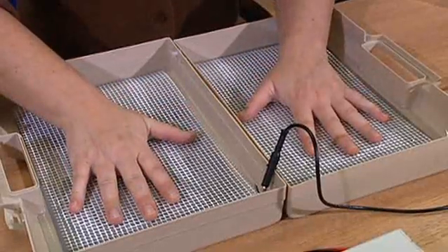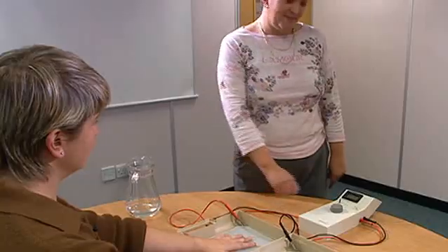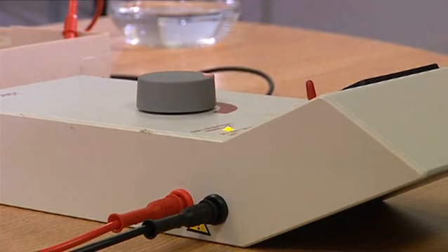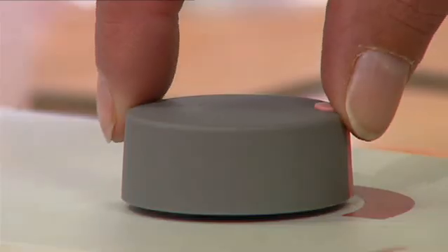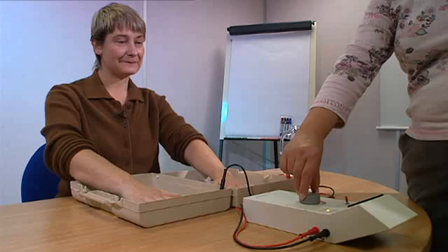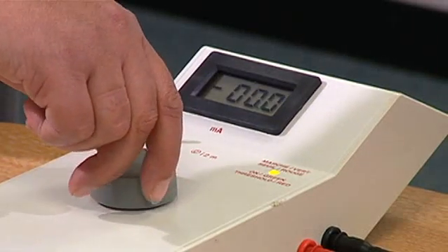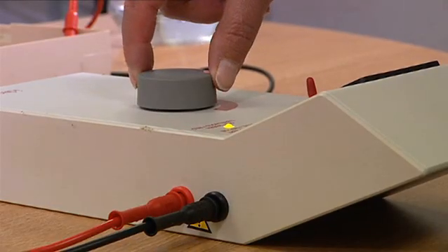When the machine is set up and the water is in the baths, you should place your hands in the baths and ask another person to turn on the machine slowly. Gradually increase the current until you feel a slight tingling sensation in one or both hands. It is important to remain at a level where you experience this tingling or pins and needles type sensation but not so that it becomes uncomfortable. The machine may need a minor adjustment to the power during treatment. Stay at this level for 10 minutes and then ask your operator to slowly turn down the current until the machine is off.